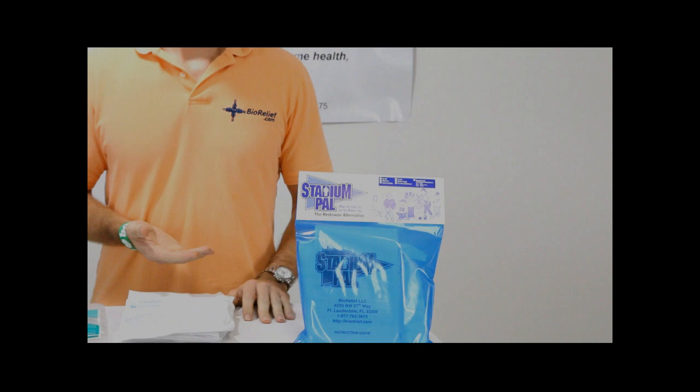Hello, my name is Jeff with BioRelief.com and I'm going to be showing you the Stadium Pal kit. Many people know about the Stadium Pal kit because it's been on The Daily Show and most famously on David Letterman when David Sedaris did a monologue on it. We're here to show you some little misconceptions about that and clear some things up.